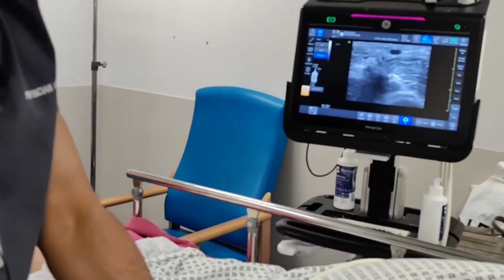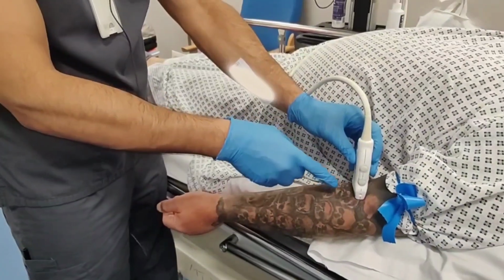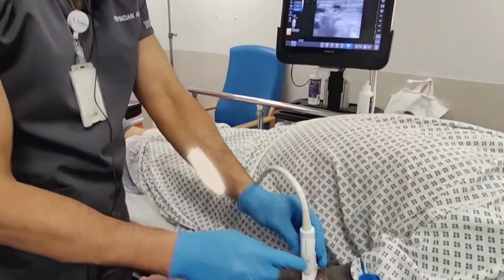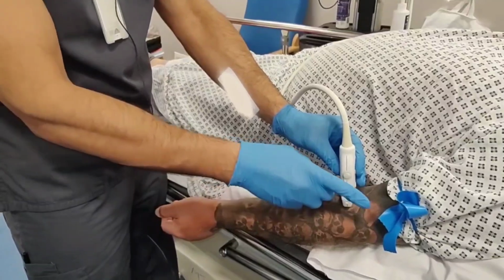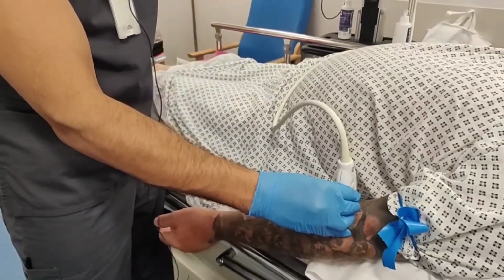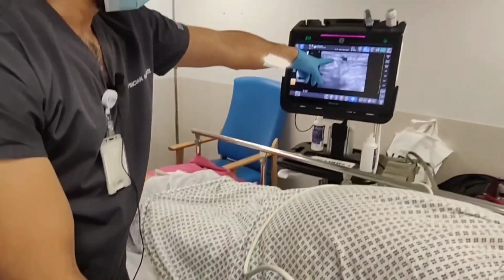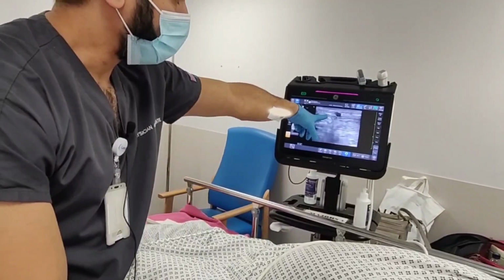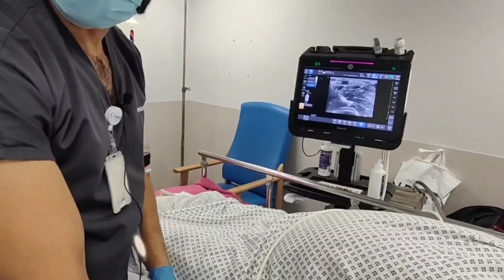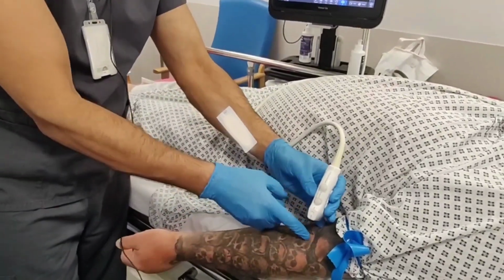What that tells me, if we come back onto the arm, is that the vein is anything but in that direction. Because I got the orientation, and on the screen it moves to that direction, that means as I go more proximal, the vein is moving towards this side of the probe. And as such, I can get the trajectory on my blood vessel. And now, if I move the probe in this direction, which is not directly straight, you'll see I can maintain the vein very much under the actual midpoint of my probe. So that's how I know the direction of my blood vessel, and that's what we refer to as trajectory. So therefore, I now know that the vein is running in that direction.